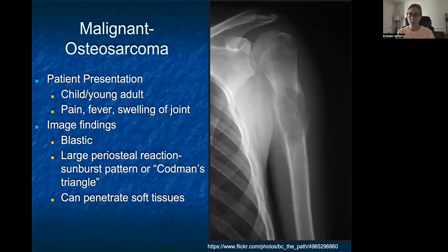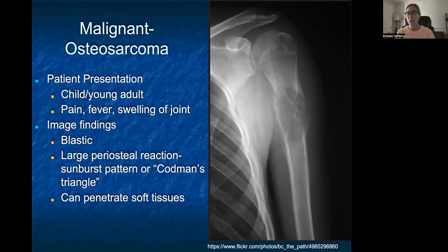For osteosarcoma, these generally occur in younger individuals — children or young adults. Symptoms may include pain, fever, chills, and swelling of the affected region or joint. On plain radiographs, osteosarcoma appears as a blastic lesion with more bone laid down within the lesion itself. Usually there are large periosteal reactions, where we see things like the sunburst pattern or a Codman's triangle, as shown in this radiograph. The lesion lifts off the native cortex creating a triangular shape. Osteosarcomas can penetrate through soft tissues, so MRI may be helpful to assess soft tissue involvement. Treatment is aggressive and likely involves chemotherapeutics and possible resection.